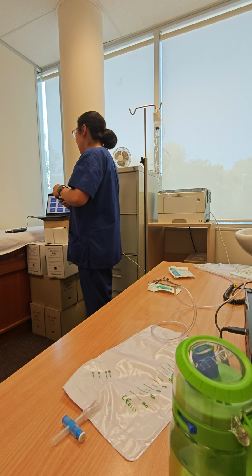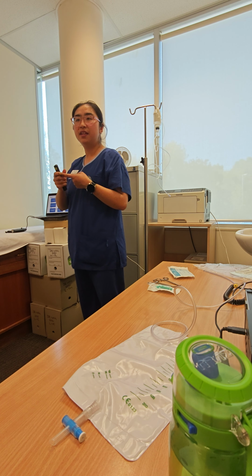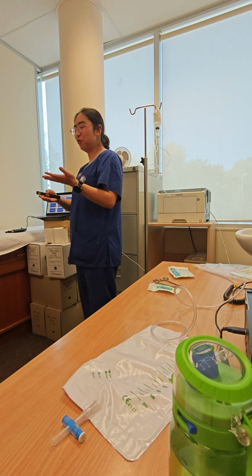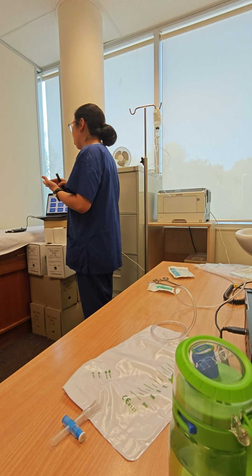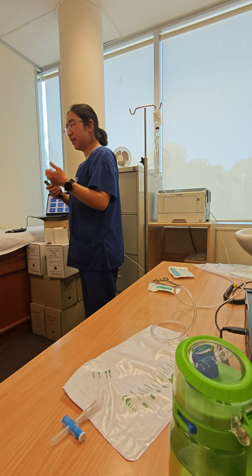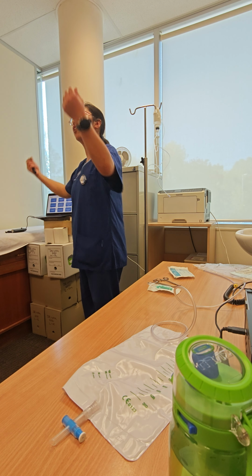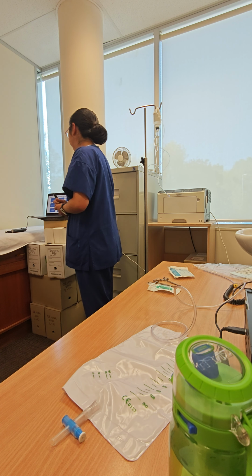That's the first important step we need to pay attention to: we need to check patient details. We need to double check name, address, date of birth, and why you are here, to make sure we have the correct patient for the correct procedure. It's not only what you read on the paper; we also need to double check that all the information is correct on the computer in our system. Everything is correct. Is that the patient? Good. We ask him to change. We bring them to the changing room, tell them to take everything off except underwear, put the gown on, and make sure it opens at the back. It's done. We bring the patient into the screening room.